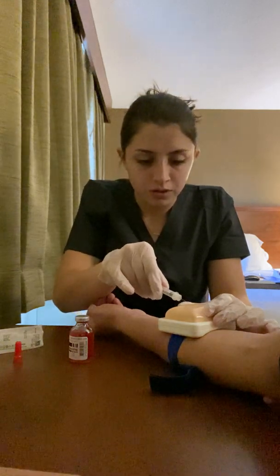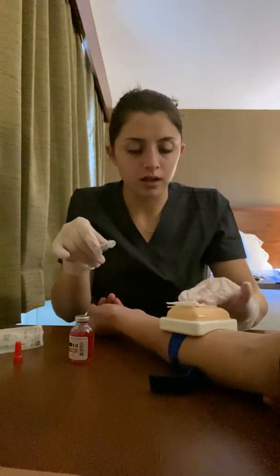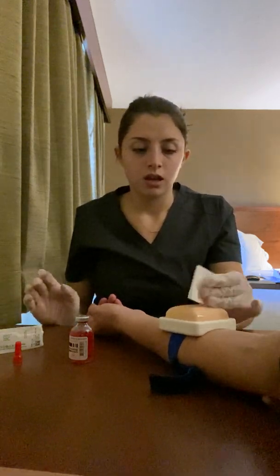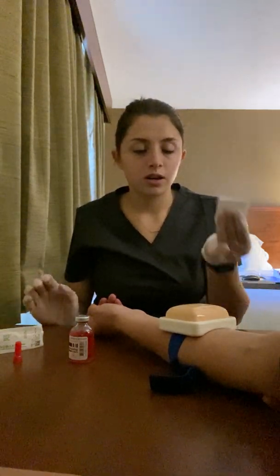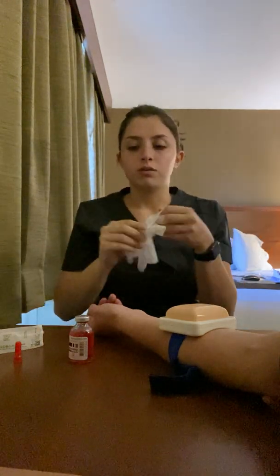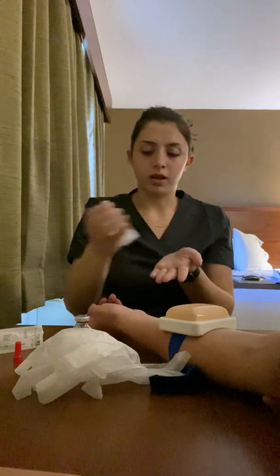Now I'm going to remove the needle and hold gauze over it, and I'm not going to recap the needle. I'm not going to massage the area either, and there's no blood, so I'm not going to use a bandage. I'm going to remove my gloves and perform hand hygiene.